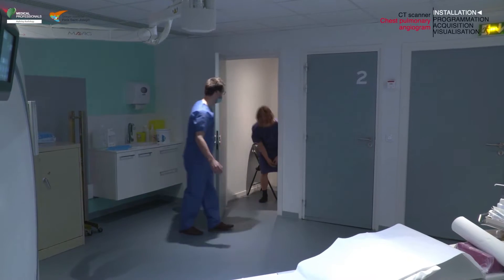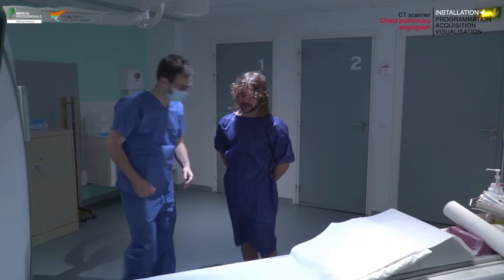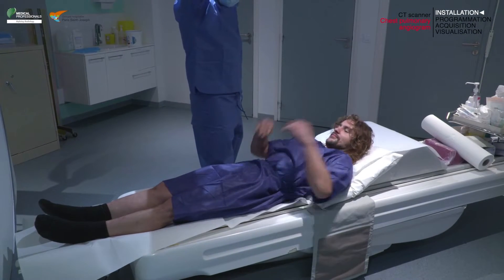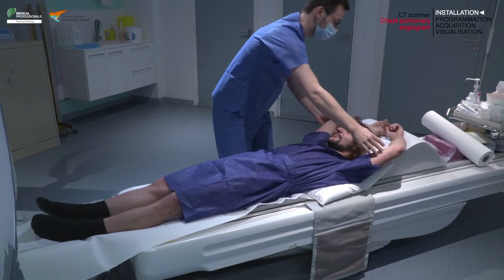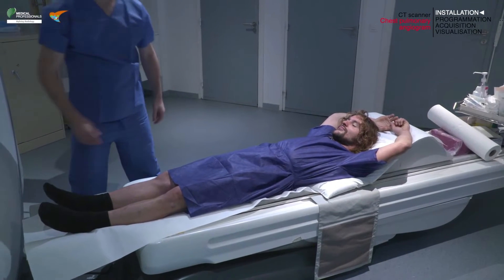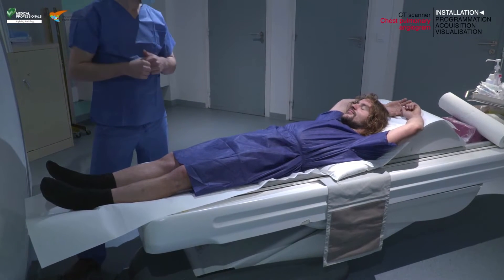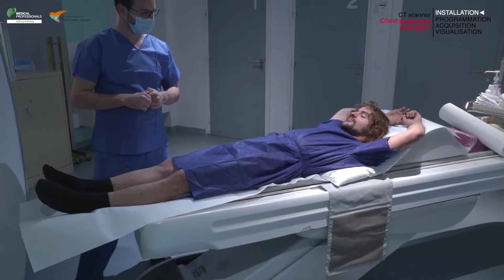After verifying the patient's identity using at least two identifiers, such as first and last name and date of birth, place your patient in a supine position with their arms above the head. For the patient's comfort, place a pillow or an incline plane under the patient's head. You can also place a leg elevation pillow under the patient's knees.